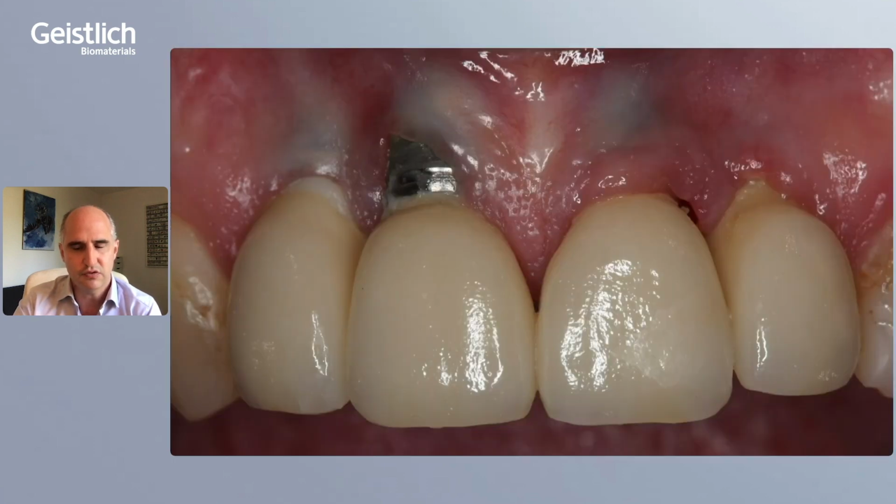Well, I would like to show you a case which I think clearly shows the differences between teeth and implants, and that it is probably a little more complex around dental implants, because we just saw that around teeth it is thickness and attached mucosa. The underlying bone doesn't seem to play that major role after recession coverage.